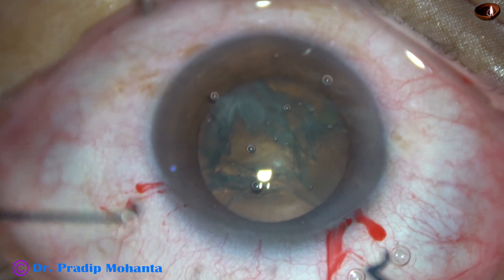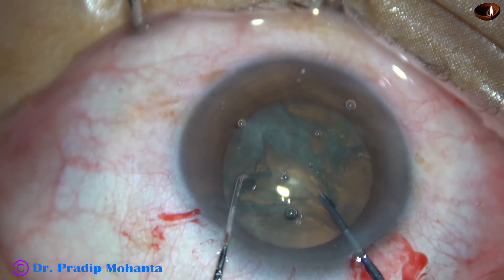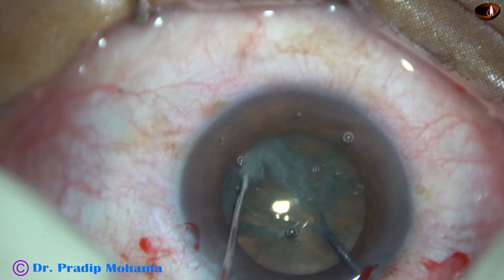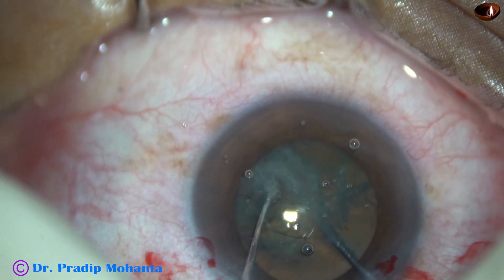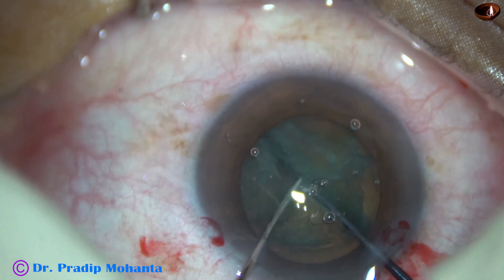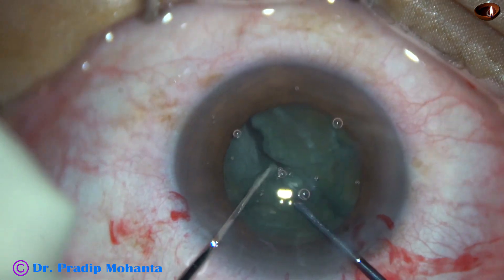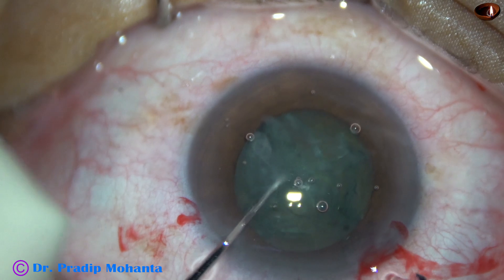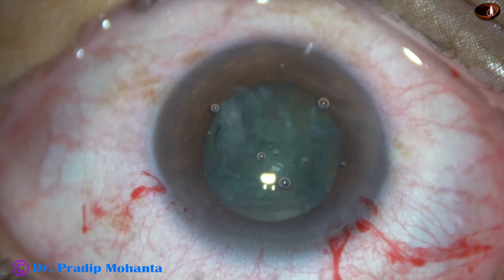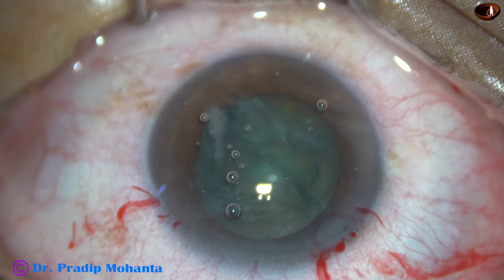The pre-chopper is taken in the dominant hand and a sustainer in the left hand. As the two instruments move toward each other, the nucleus remains static. The nucleus is divided into two halves. This is a very soft cataract, so just two halves is sufficient.